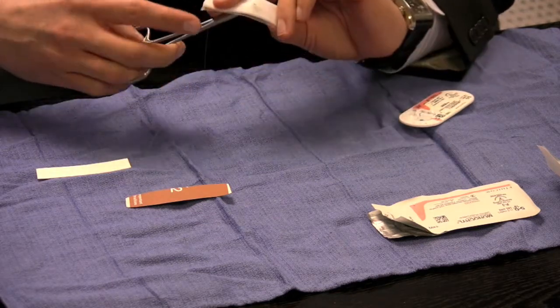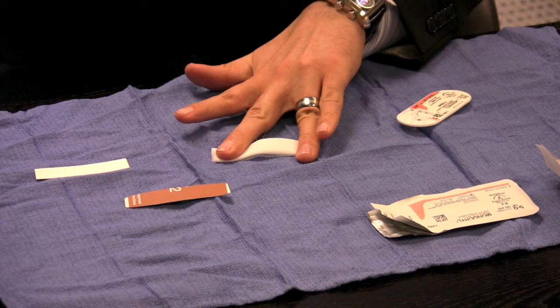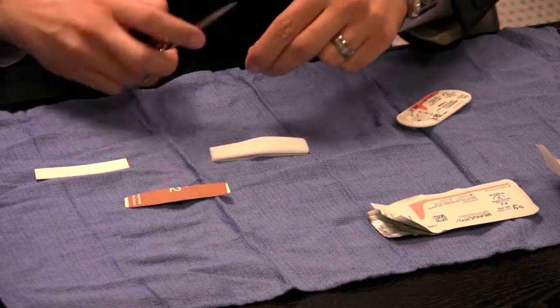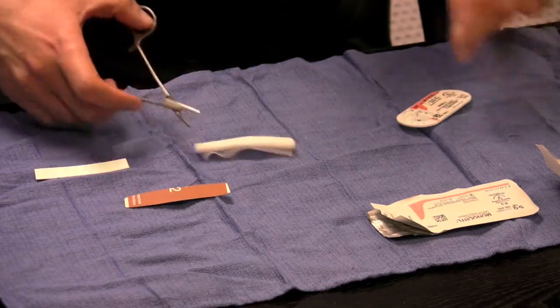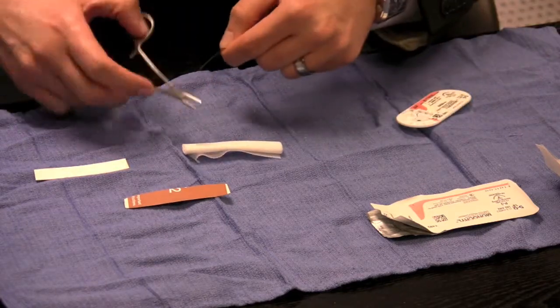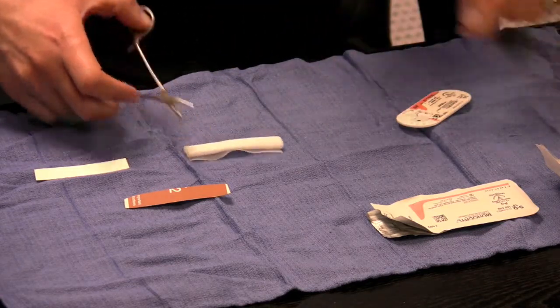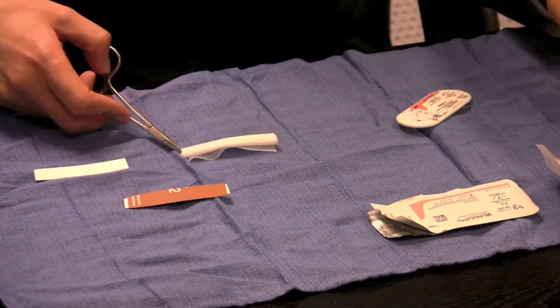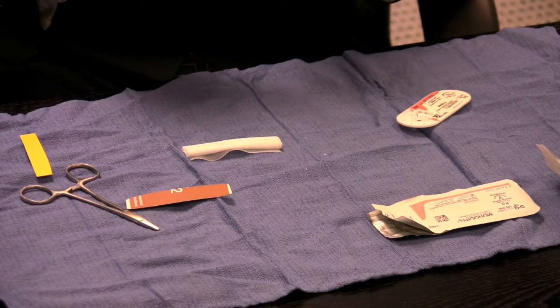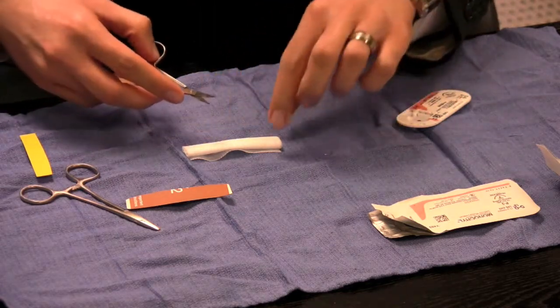Now sometimes I'll use a blue stitch just to be able to visualize it better, but these sutures come in different thicknesses, different material, but again, what I prefer are these absorbable stitches. What it also tells me is where the midline is once I cut it. So when I'm in the OR and I'm cutting this and shaping it, the stitch shows me where midline is. So when I'm in the OR, I'll take the same stitch, a blue version of it, and I'll place that.